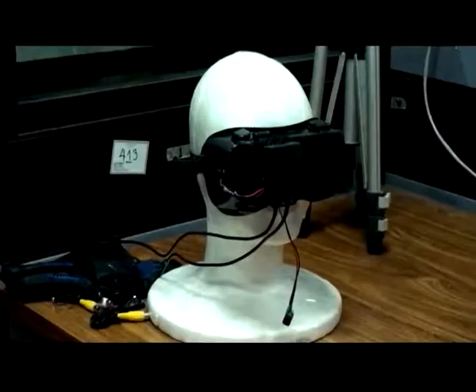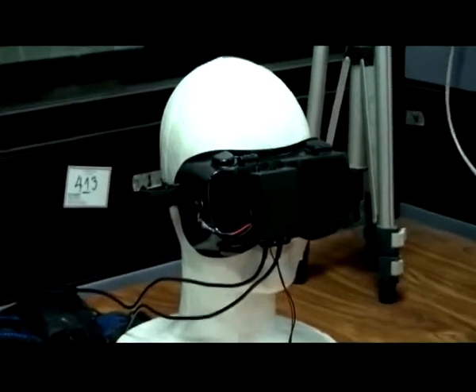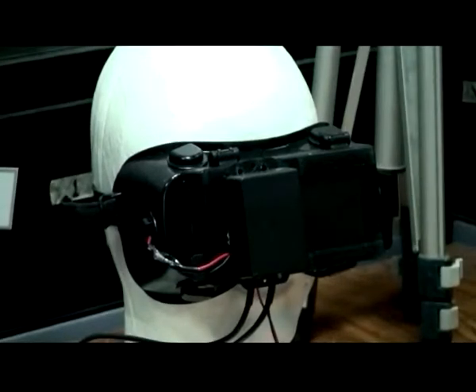camera, as you see here. So we install the camera in the low-cost goggle here, and then the user can wear the goggle, and they can move their head freely.